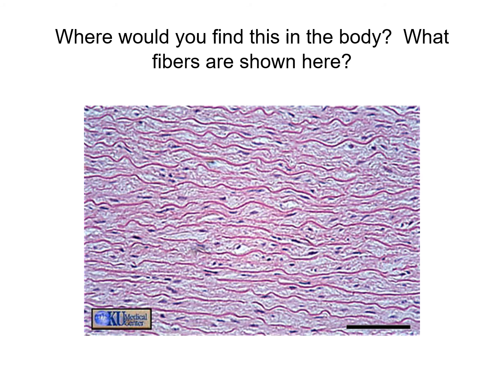It is actually elastic tissue that you would find in elastic arteries like the aorta. So those wavy fibers would be found within the tunica media.